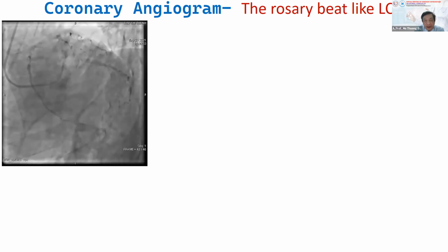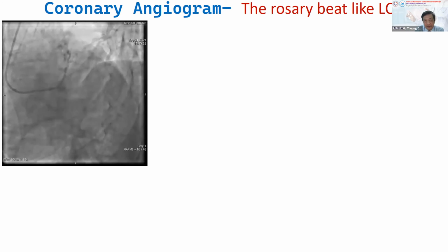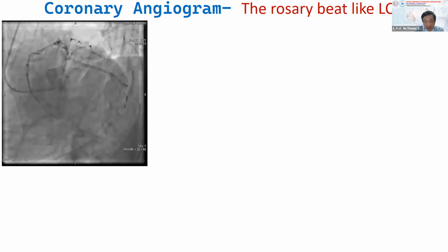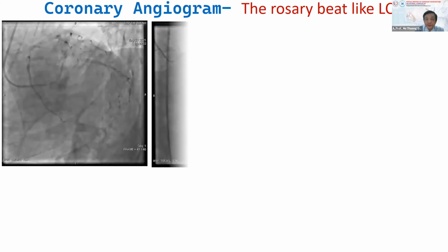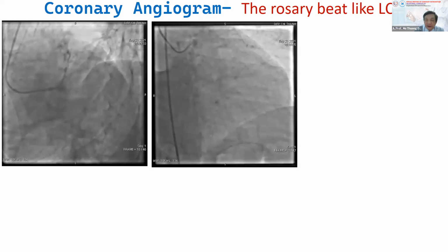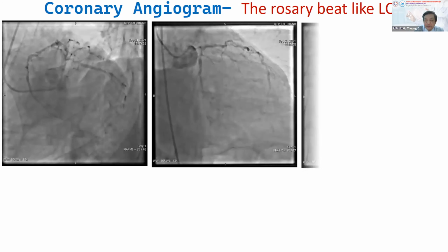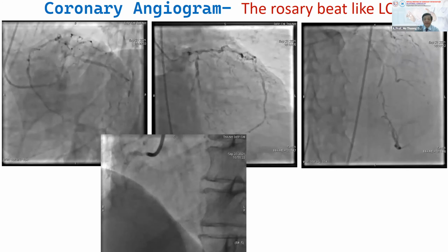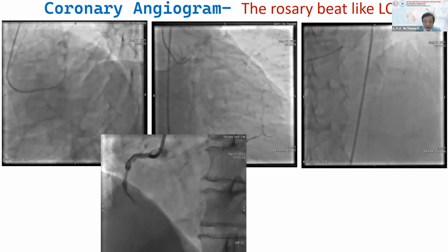This is the left coronary artery. We can see a heavily calcified left main lesion. Distal left main involves the bifurcation, ostium and proximal of the LAD and circumflex. And a long diffuse lesion along the LAD. On the right, very calcified proximal and mid segment of the RCA.